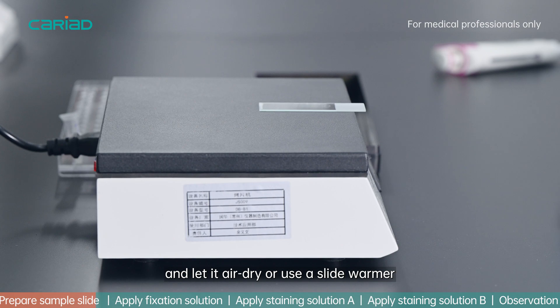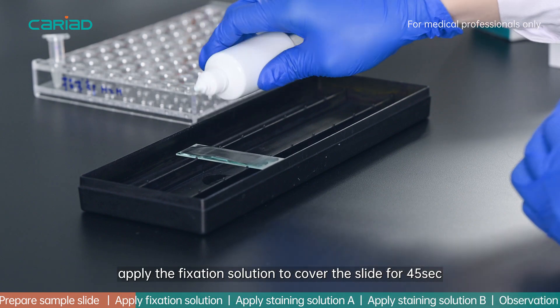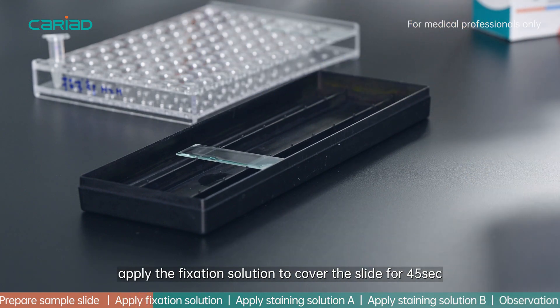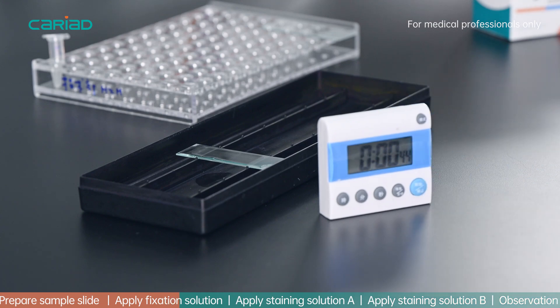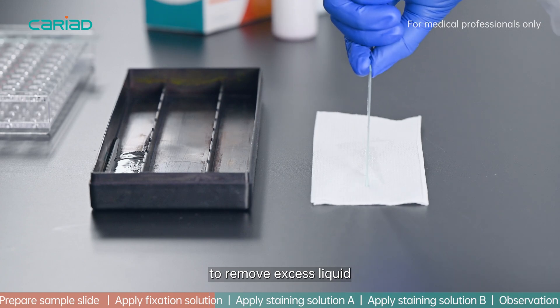Place the slide horizontally and let it air dry, or use a slide warmer. After the slide is dry, apply the fixation solution to cover the slide for 45 seconds. Hold the slide upright on an absorbent paper to remove excess liquid.